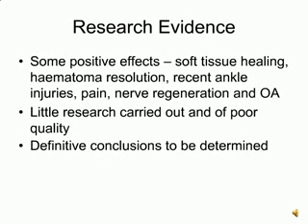The research evidence for the effects of shortwave diathermy and pulse shortwave diathermy have demonstrated some positive effects on the following conditions. There has also been conflicting evidence. Overall, however, there has been little research conducted, and most is of poor quality. Definitive conclusions cannot therefore be made on the basis of existing literature.